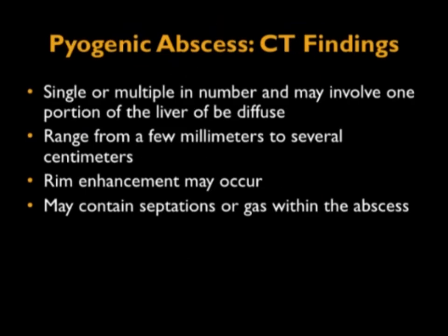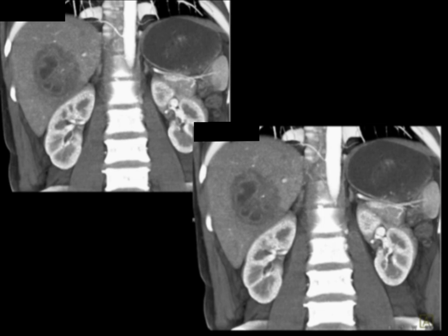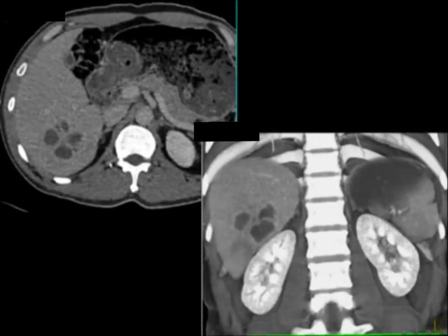Pyogenic abscesses can be single or multiple, may involve one or multiple portions of the liver, range from a few millimeters to a few centimeters, and rim enhancement may occur. Here's a cystic low-density lesion — could this be an amoebic abscess? In fact, that's what it was. Right lobe of the liver — you've got to be thinking amoebic, though it could be E. coli or bacterial. You can see a pseudocapsule, and inside are what look like satellite lesions. When you see a cluster of things, be thinking about the possibility of abscess — including hydatid disease, which often has a pseudocapsule.